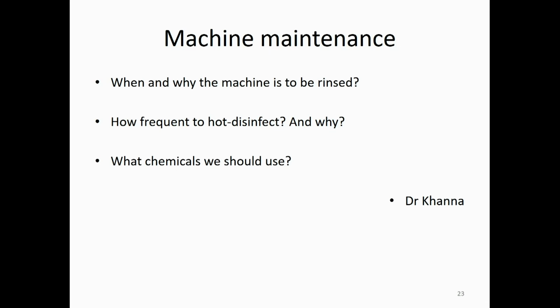So it has to be cleaned. And the vessel which you use for a big preparation has to be conical, it has to be drained completely, it has to be washed with RO water every day, and every 7 days it has to be cleaned with hypochlorite. And even the tubing, if there is a continuous system, it has to be flushed. Otherwise, you may have biofilms and then all this infection which can happen.